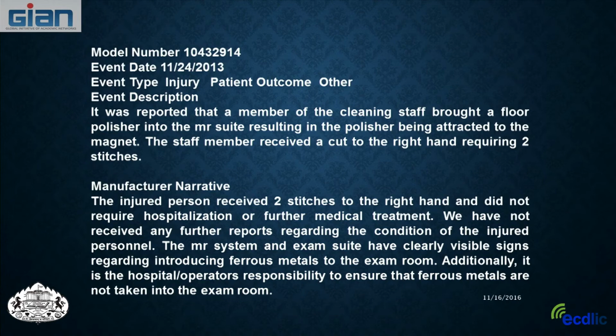So again, these signs are clearly visible about how you should not take metal into the environment, but people tend to become careless and complacent. And sometimes you have new cleaning staff who aren't informed and completely aware. So you really need to take the time to educate anybody who's going to come into this environment about the dangers of it.